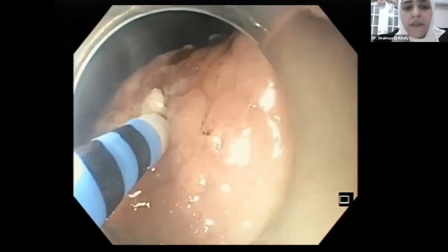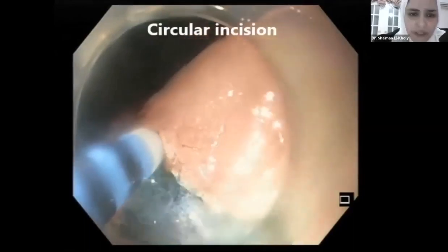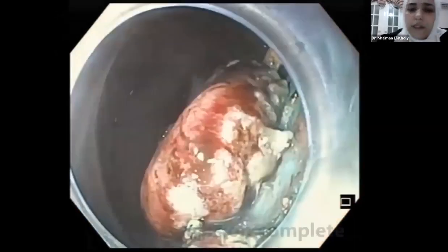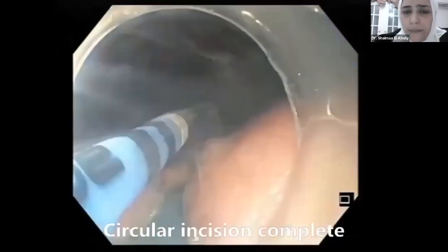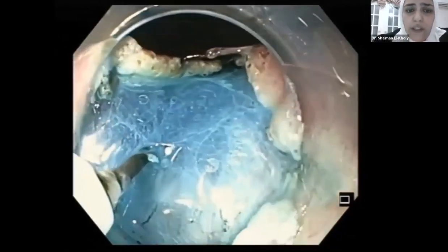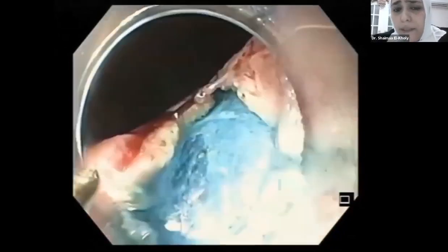It's not mandatory that you complete the whole circular incision. You can leave a final part till the final dissection. And here you can see that we are performing the circular incision and it's almost complete. Then we start dissection. You can see here the submucosa looks blue. I hope you can see the video clearly.